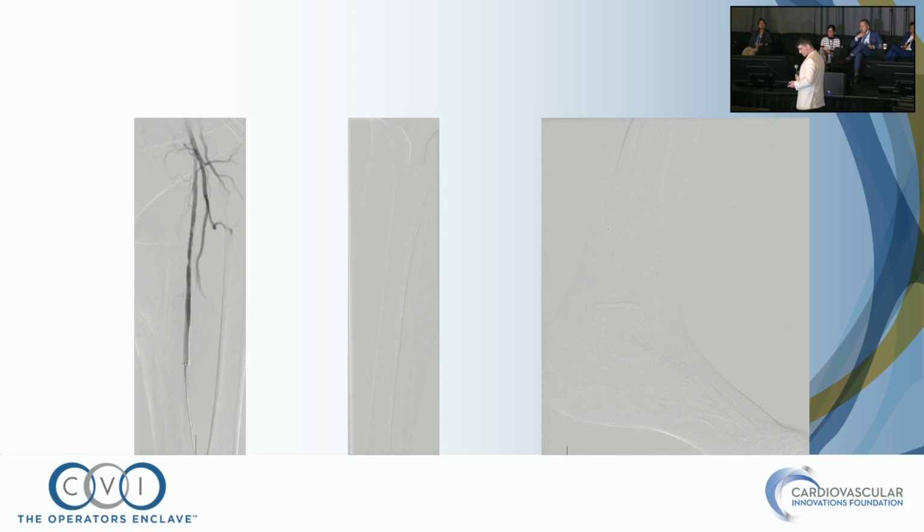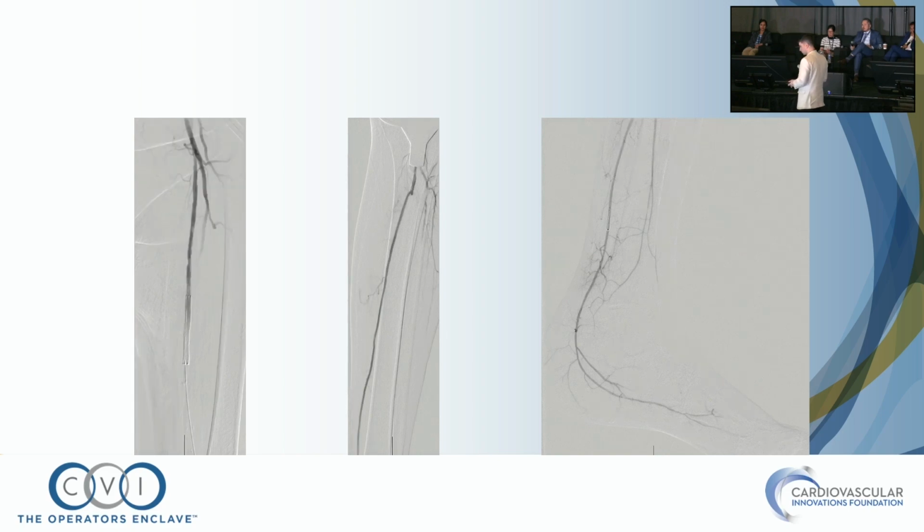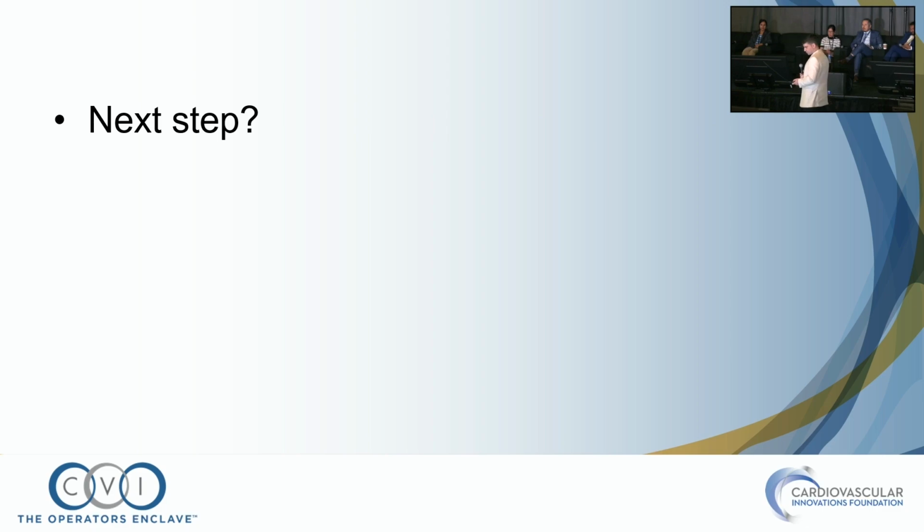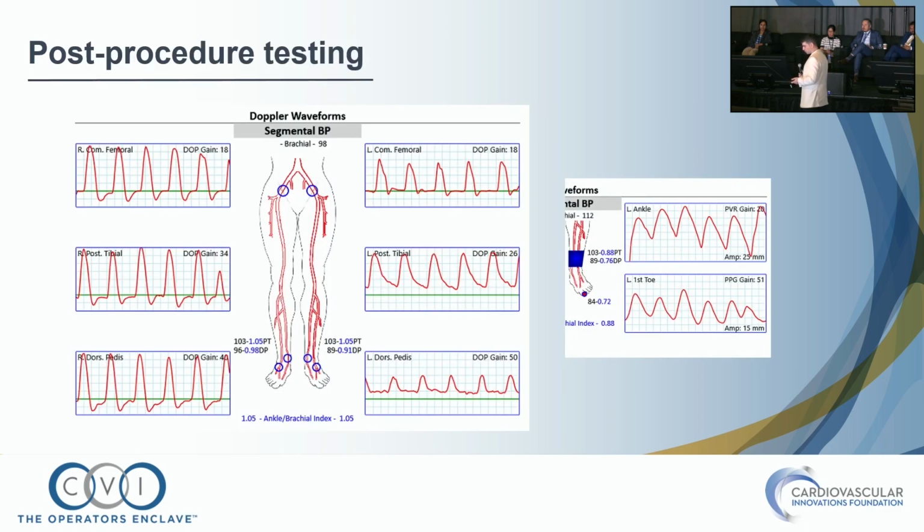Here we go, that's the SFA lesion now. And that's below the knee, and no surprise, sometimes, as I said, less is more, but thankfully it went to the peroneal, and the PT where the wound is stayed open. At this point of time, of course, I'm not going to chase this peroneal, I'm just going to accept the result and call it a day. I think we got good flow to take care of the acute limb and also take care of that one that she had. So next step, of course, no more stop.